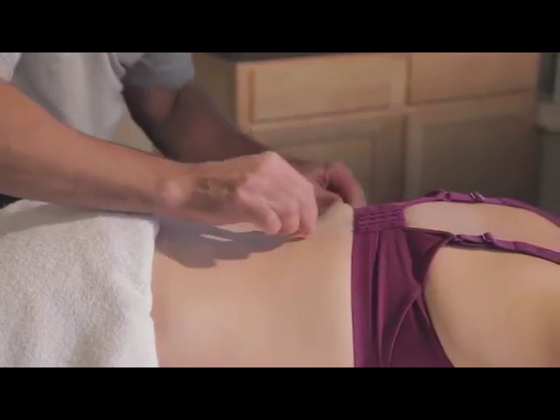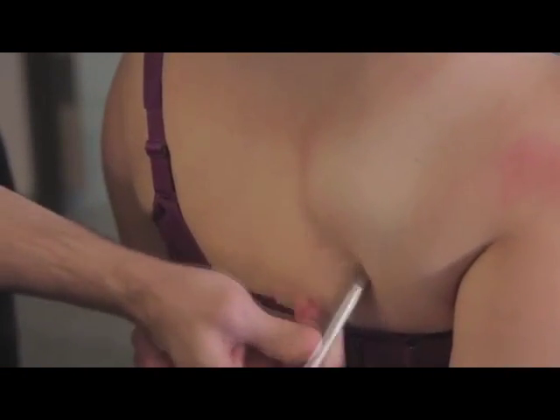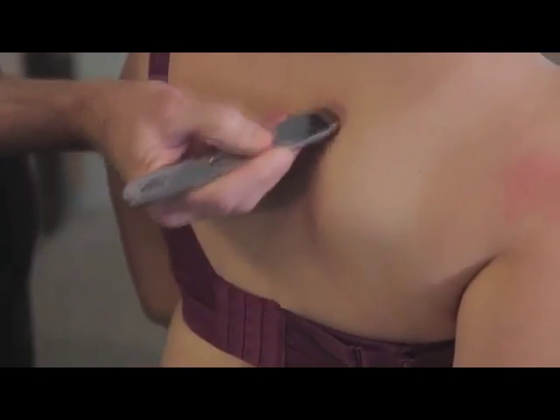Treatment duration really varies by the injury. The longer an injury has been sustained or is there, the longer it will take to recover. So acute injuries typically respond quicker than maybe more chronic injuries. But typically we'll treat patients maybe for about 10 minutes or so with the instruments.